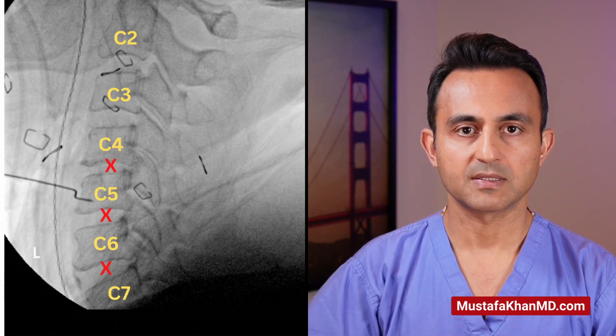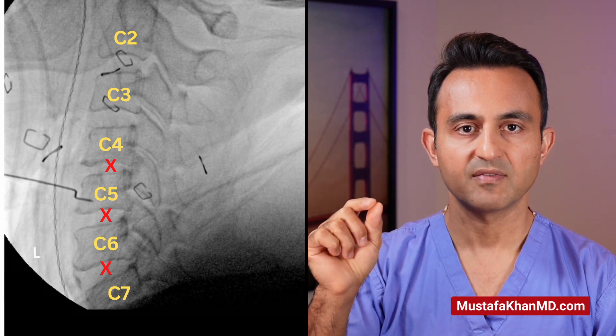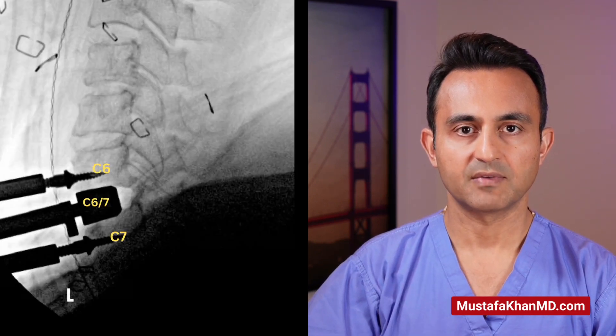In the case of this patient, I needed to remove three discs: the discs between C4-C5, C5-C6, and C6-C7. I began by starting at the C6-C7 disc. Temporary pins are placed in the two bones, C6 and C7.